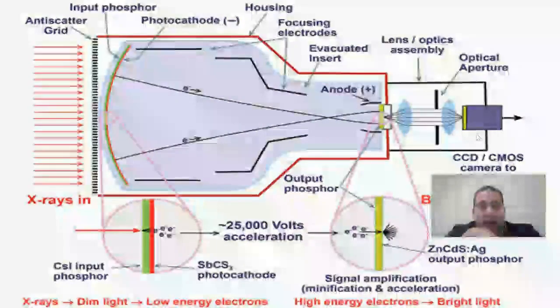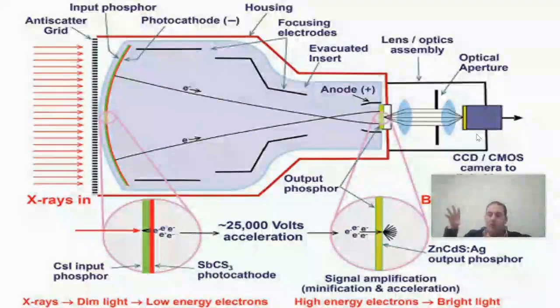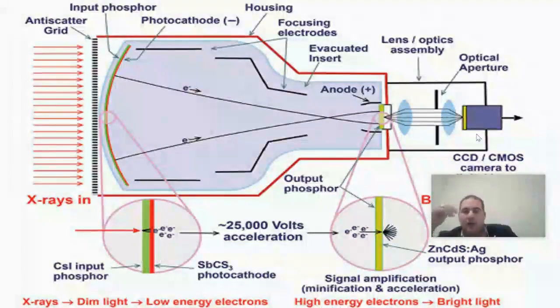If you remember, all televisions had a part that contained the cathode, which would extend out from the back. There was a screen and a cathode ray tube, all of which was vacuum sealed. You would find the cathode coming out from behind. All the TVs were like that, until now. But this concept has faded and changed, and the mechanism is different now, and all the screens have changed.